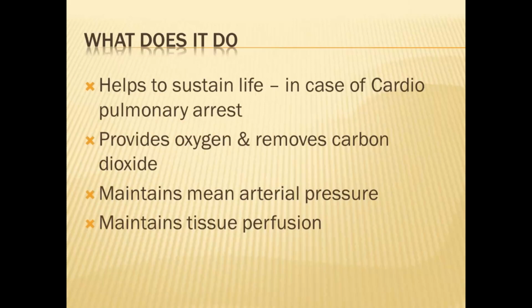So how is ECMO going to help in this manner? It helps to sustain the life. It helps in gas exchange, and maintains the mean arterial pressure and tissue perfusion. That's the reason you don't need to support them with very high levels of ventilator and very high inotropic support. And that's the reason we can at least get rid of iatrogenic causes and help the patient to recover fast. It will decrease the inotropic requirement, decrease the ventilator requirement, and give rest to the lungs and rest to the heart.